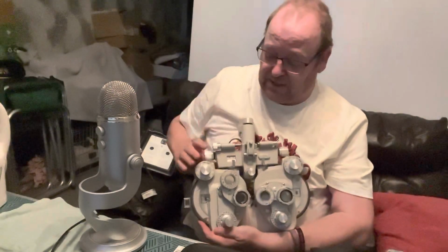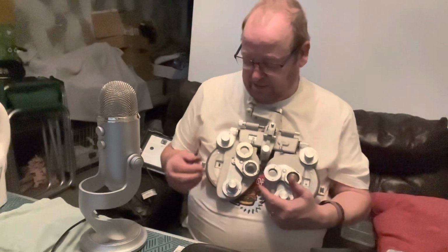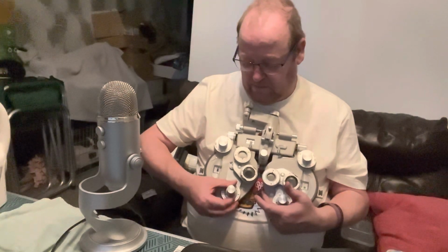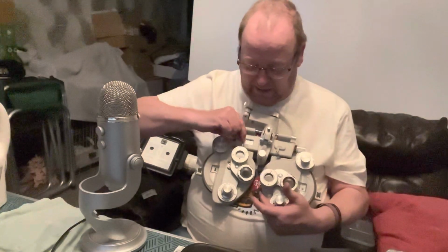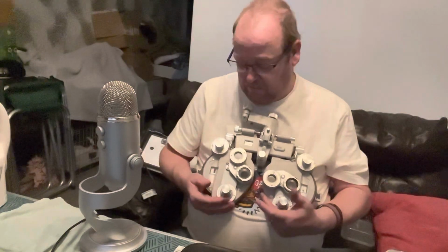And I'm just finishing off now with a phoropter head. You go to a lot of modern opticians now, and they do your eye test with one of these. And I've purposely not got this on a stand. I'm not going to really use it much, but it does all the different types of vision checks. See, it even changes the angle of the head. It can also flip the lenses.